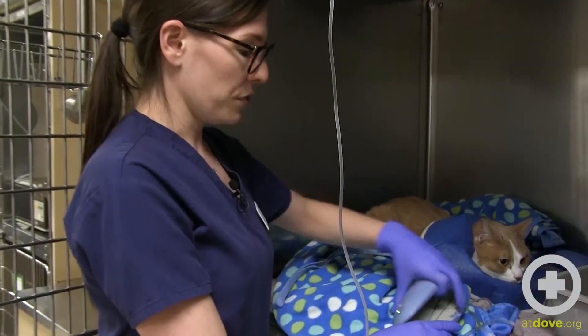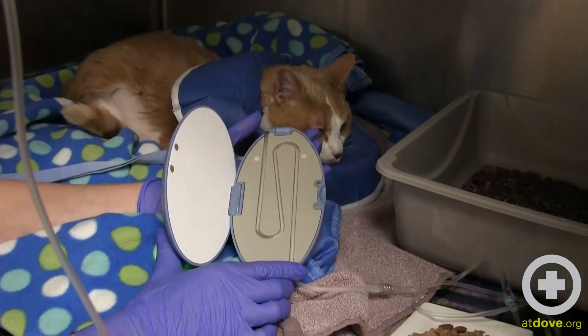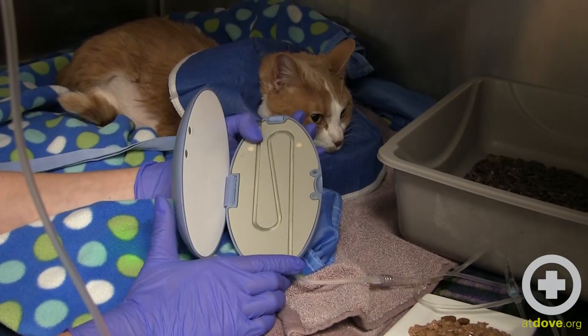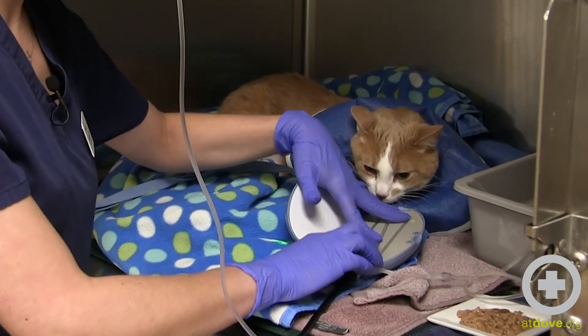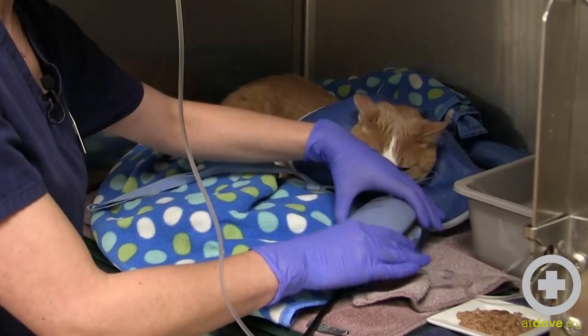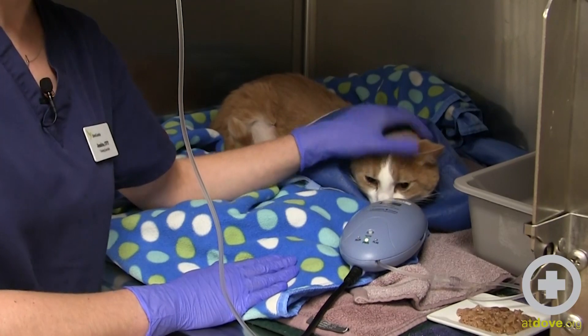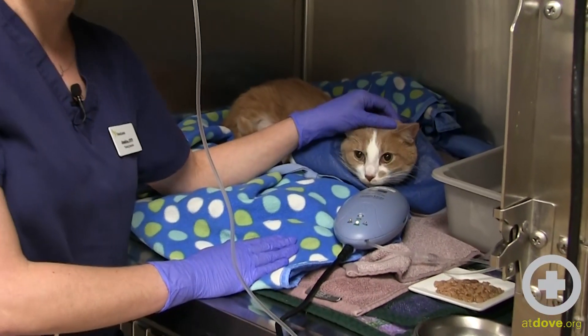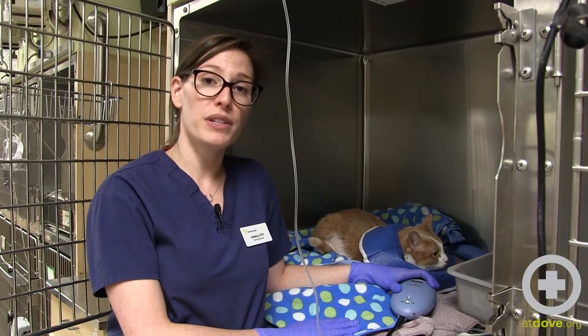You will open your fluid warmer and then position it close to your patient. Remember that the closer you put it to your patient, the warmer the fluids will be when they reach the patient. Once you've put your fluid line into the groove that is in there, close it and make sure that it doesn't catch anywhere, and it will tell you on the front that it is heating up to the appropriate temperature. This will continue to warm the patient's fluids as they receive them, and that is how you use a patient fluid warmer.